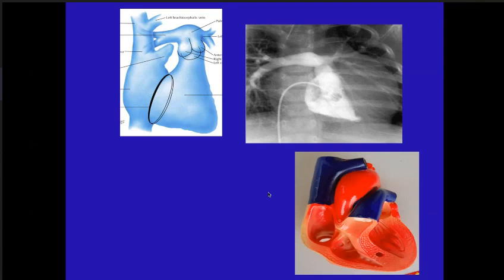Now let's come to the right ventricular angio. Now, when you do a right ventricular angio, what view is this? Come on. Now, this is practice for you. What view is that? AP view, sir. Because AP view only, sir. Yes, because both the ribs are symmetrical. The vertebral, the spinous... what is this called? Pedicles of the vertebrae are exactly symmetrical, and the spine doesn't appear rotated. So it is a straight AP view.